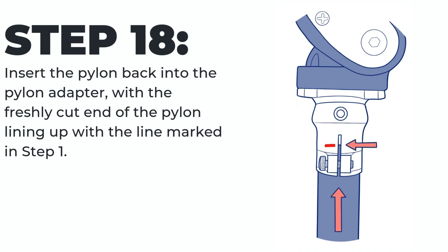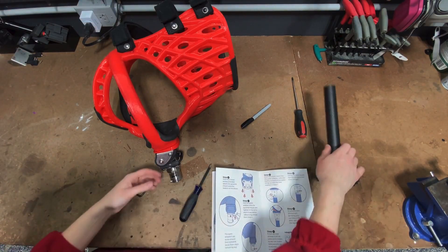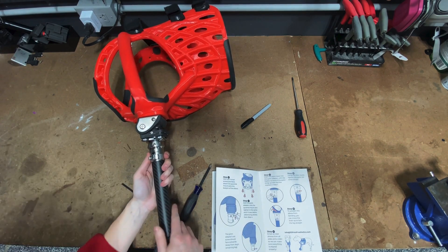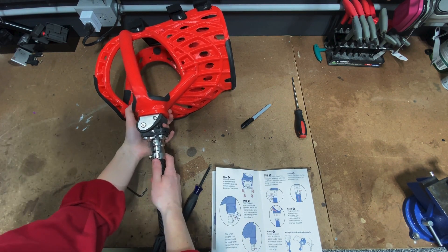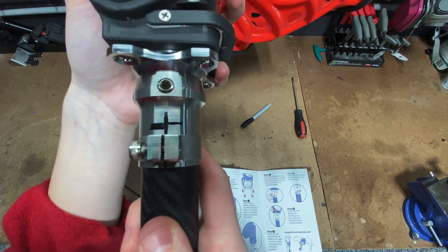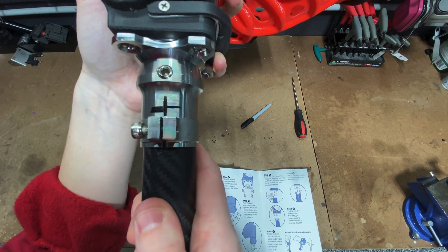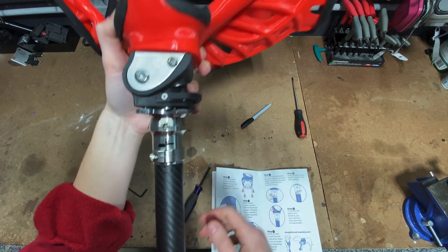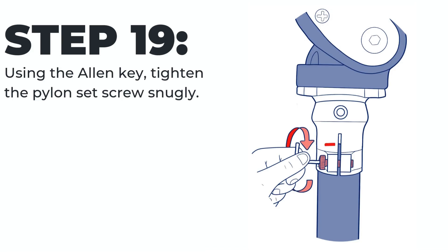Step eighteen: insert the pylon back into the pylon adapter with the freshly cut end of the pylon lining up with the line marked in step one. Step nineteen: using the allen key, tighten the pylon set screws snugly.